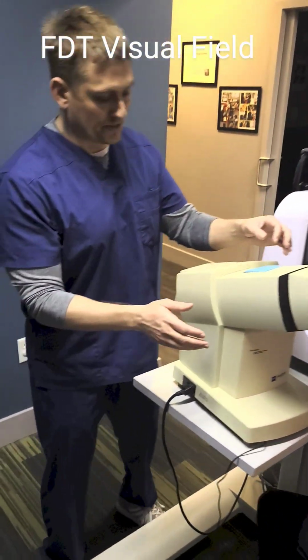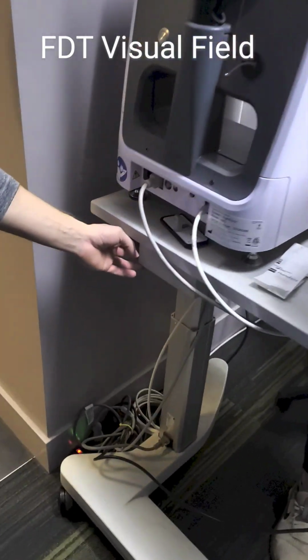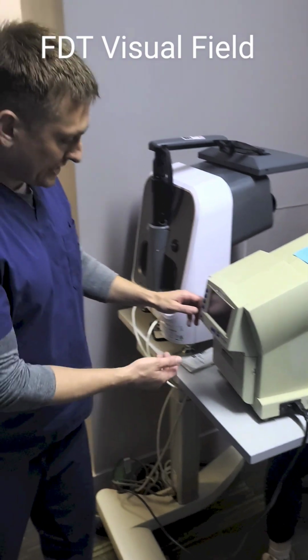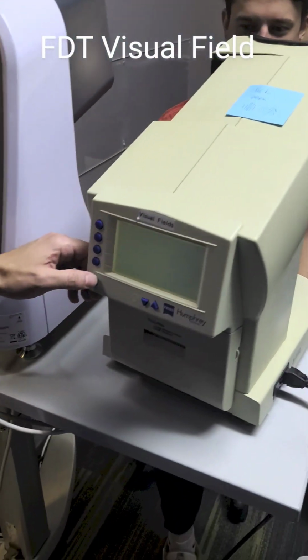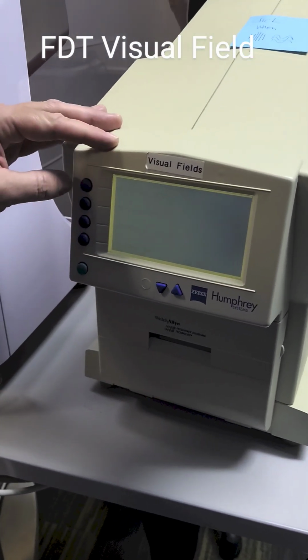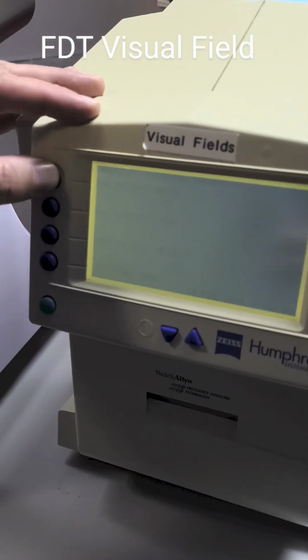Once they're pulled up to the machine, you can adjust the height of the table using these buttons here off to your left. And to get the test started, hit the green button. The green button, you can keep on hitting it until you hit the home screen. This is the home screen here. You're going to want to hit the button next to Run Patient Tests.